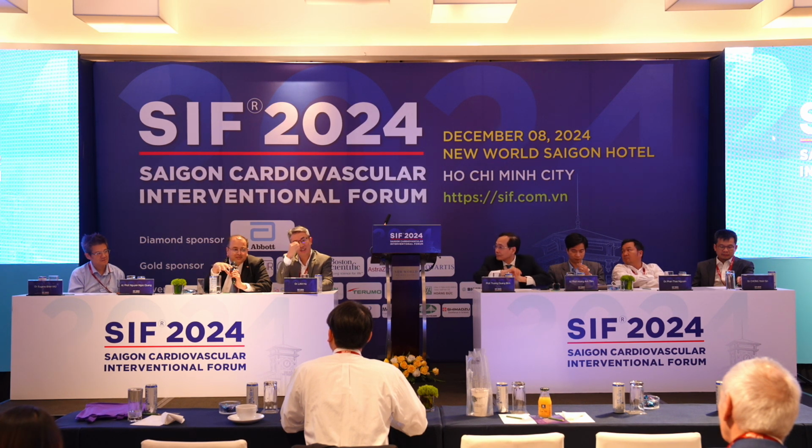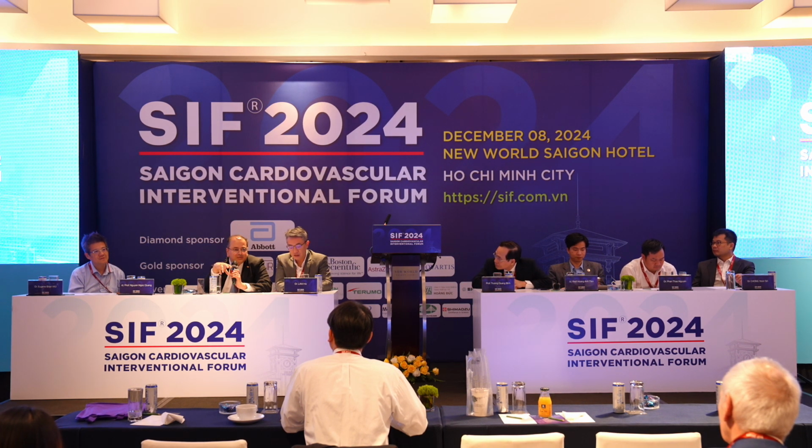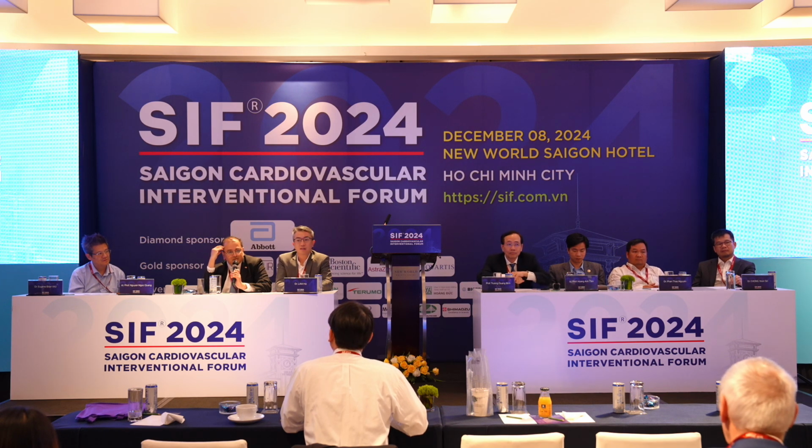But I'm still puzzled. I do not think that it's just too much thrombus. Are we dealing with some hematological issue, antiphospholipid syndrome and things like that? Even in your OCT, the disease was not so obvious to me. And I think once you see TIMI 3 flow, just medical treatment would actually have dispersed the thrombus. You could have treated it, so I think there's something else going on. You don't see that much thrombus everywhere. And trying to chase the tail, trying to suck it out, it just doesn't work that way. It will come back. It's just too much thrombus. And you can see his vessels, and he's so young. His vessels are so big, so healthy. I think there's something else going on. That's my opinion. Thanks.